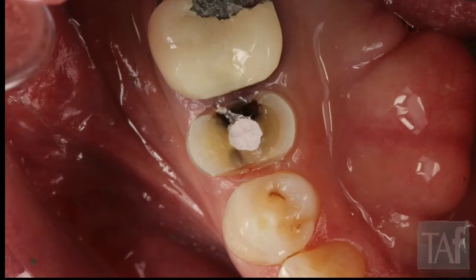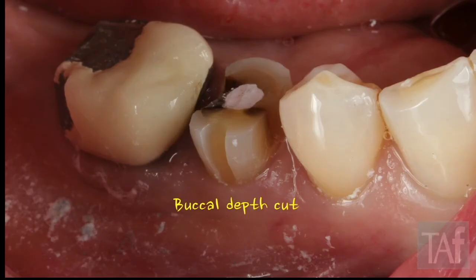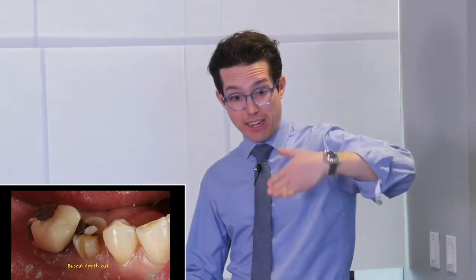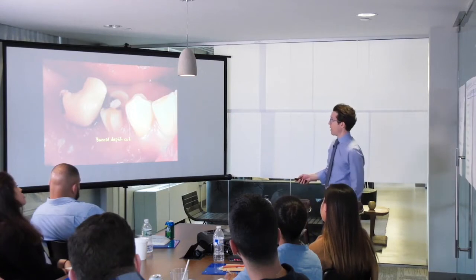So that's what it looks like with my initial two cuts — occlusal and interproximal reduction. You can see it's not overly aggressive in texture but it's definitely a little more roughened up. Then a buccal depth cut — almost the same thing as the occlusal, except you don't want to end up with a J-shape margin and you have to be very careful about that. With a round-M chamfer, which I'm using for everything now because of the materials, you can't end with a J-shape finish line — it's not going to scan or impress well, and it won't finish well to a crown. So you're only burying the bur halfway, with the tip still visible so you don't create a concavity underneath the margin.